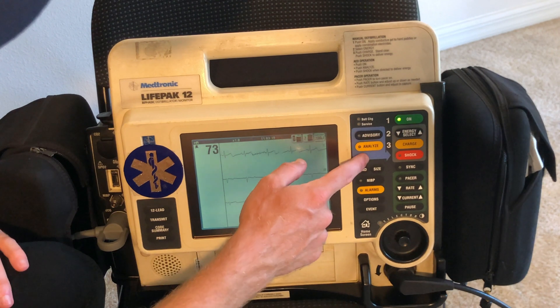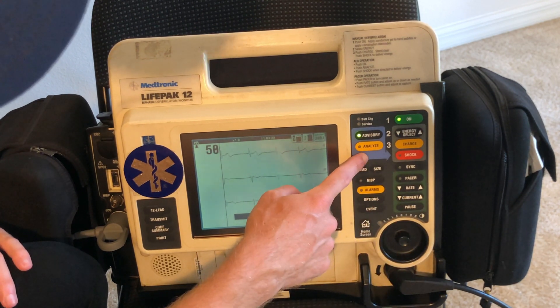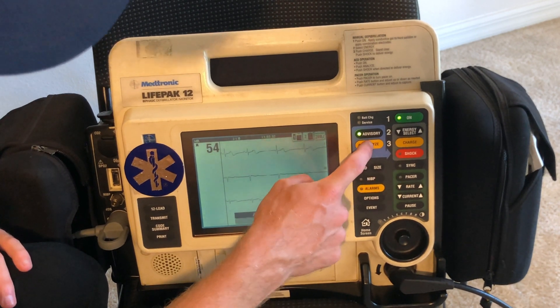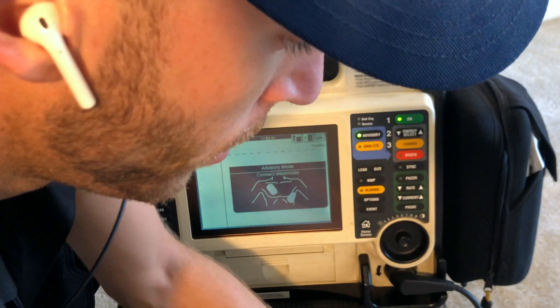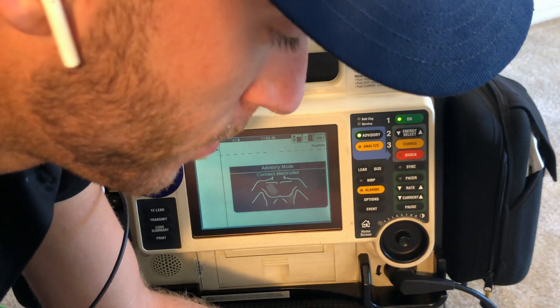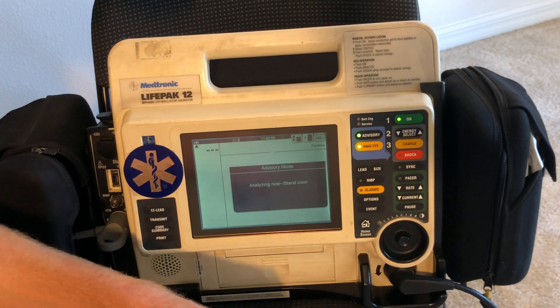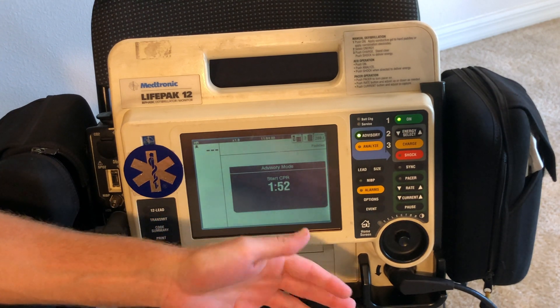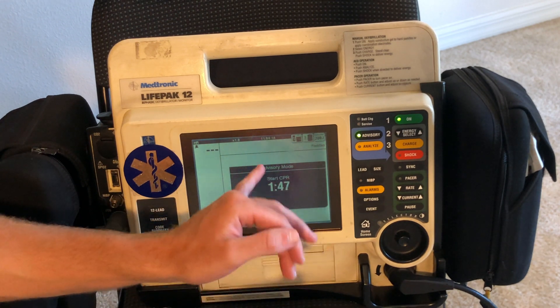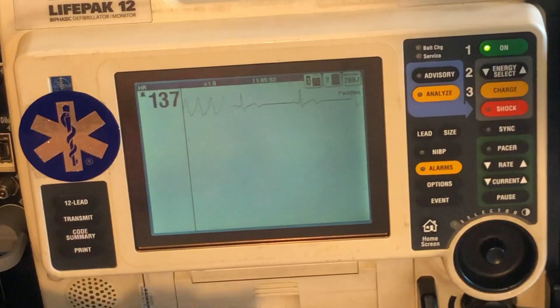All right, pretty cool — we have here the AED mode. So I can hit advisory, and then what I'm going to do is hit analyze. It's going to actually analyze the heart rhythm to see if it's shockable or not. So we connect the pads up, push analyze, and it will actually tell you how to use it. Analyzing now — stand clear — analyzing the rhythm — no shock advised, start CPR. So you can see the LifePack will actually put you through an AED and follow the steps. I have it on asystole right now, which is why it's saying start CPR.